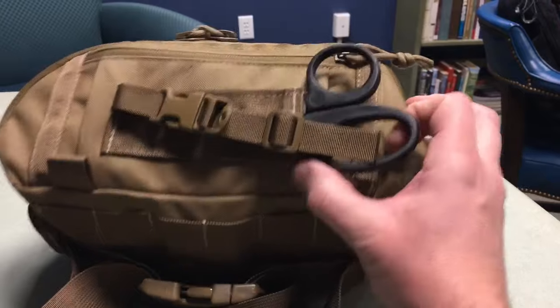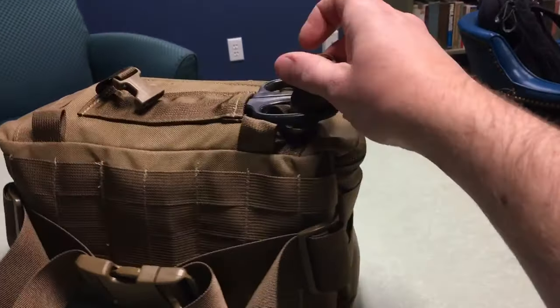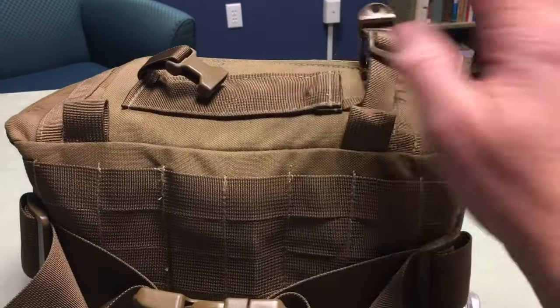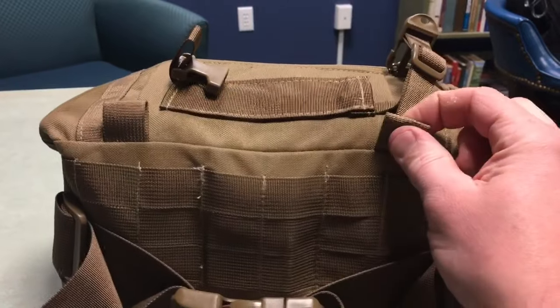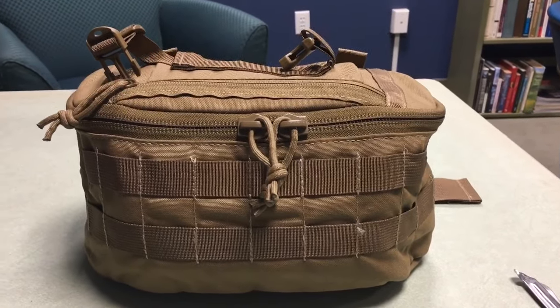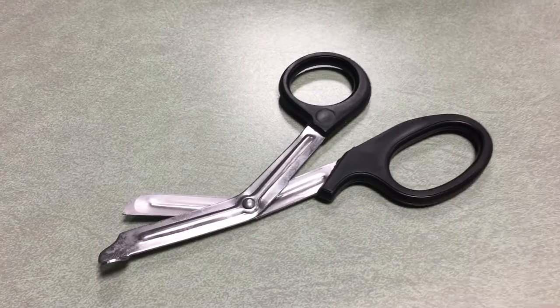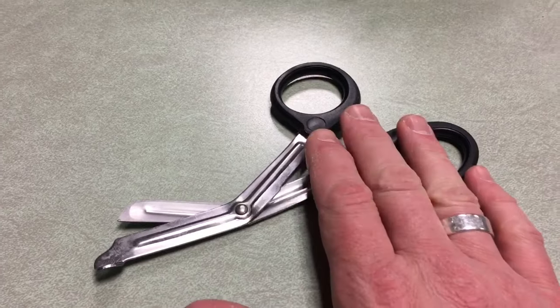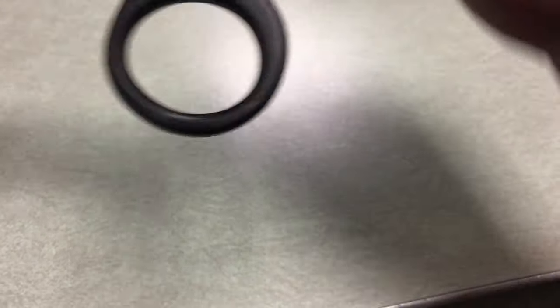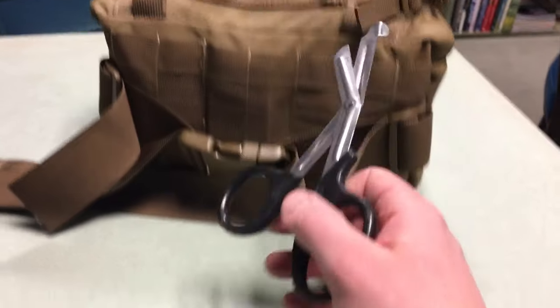Up on the top they've included shears and a little pocket to carry them in — you unclip that and the shears come out. It's stitched in, with some loops so you can attach it to gear as well. Then there are nice big zippers on the front. As for the shears, I do have a set from Leatherman — I believe they're called the Raptors — and I'm probably going to swap these out. These appear to be stainless, made in Pakistan.